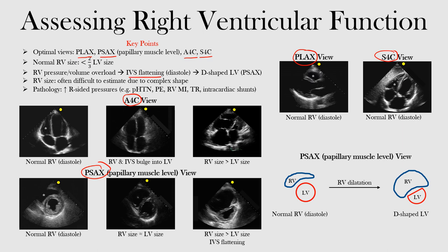We can specifically see that in diastole, and this results in a D-shaped left ventricle. Looking at the parasternal short axis view at the papillary muscle level, this is a normal right ventricle during diastole — there's your right ventricle, your RV, and this is your left ventricle, the LV. Notice the size of them.